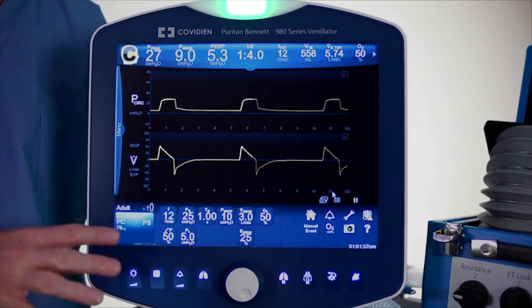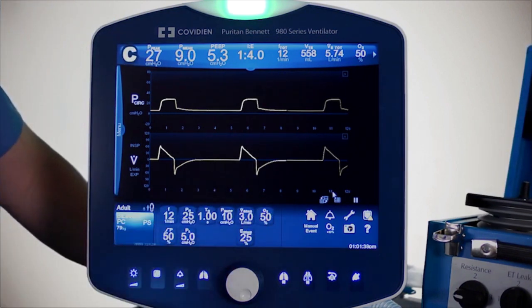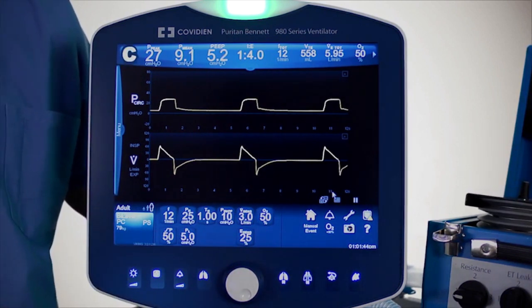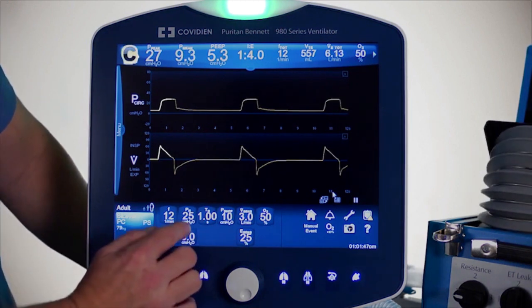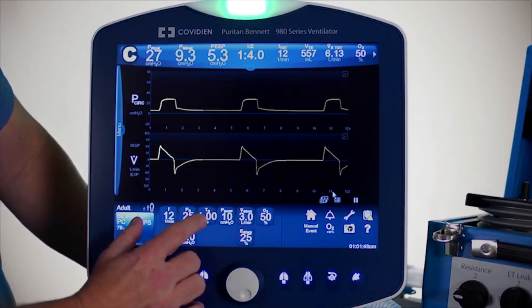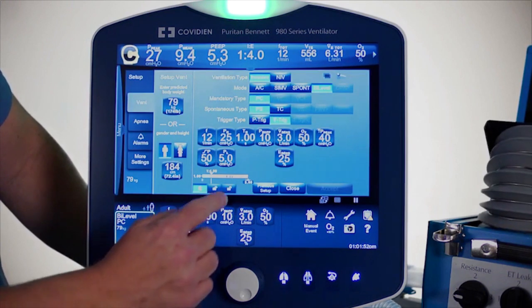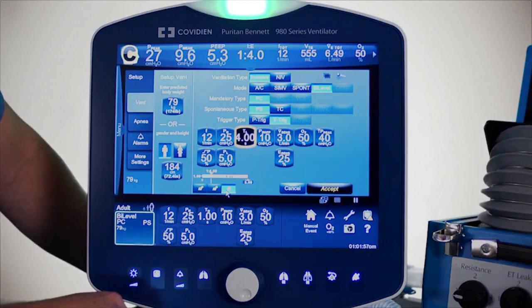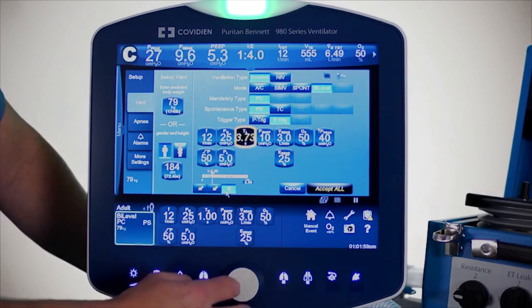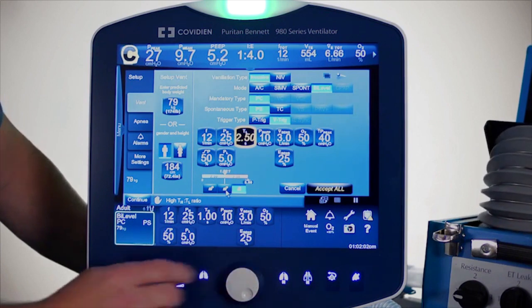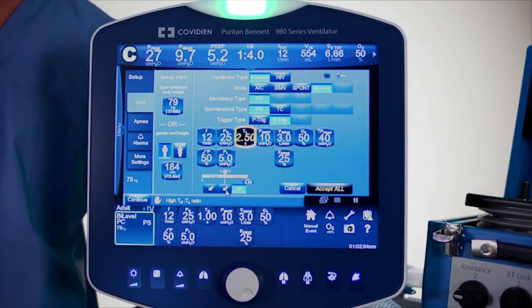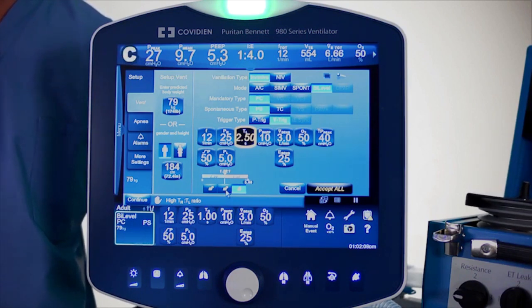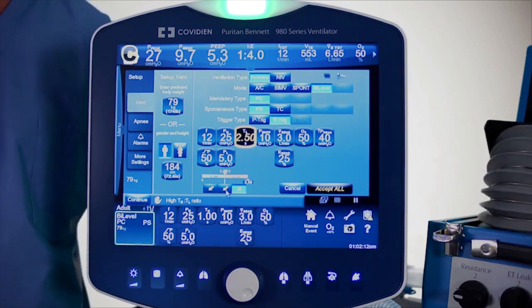This is what conventional ventilation looks like with some pressure support set. Many people will use this in an inverse strategy, so let's look at that now. Going back into settings and setting the expiratory lock — time low — and beginning to dial it down. When thinking about APRV, time lows are usually around 1 second, but they can be longer or shorter. For this example, using roughly 0.8 seconds.